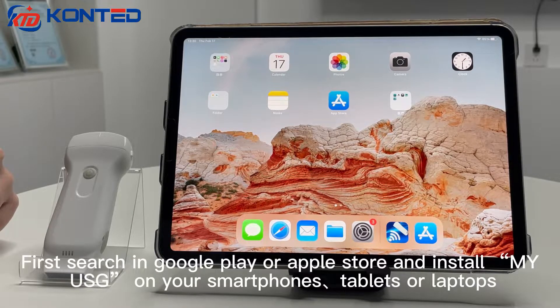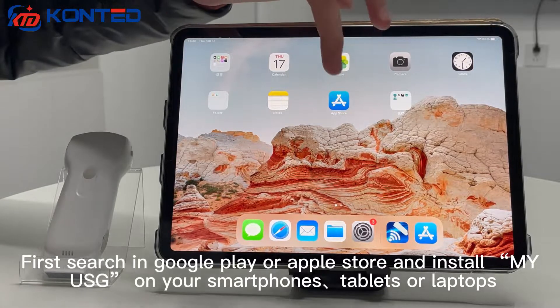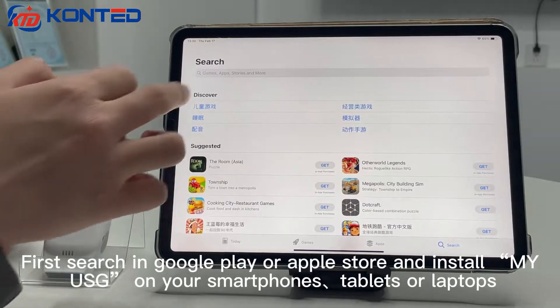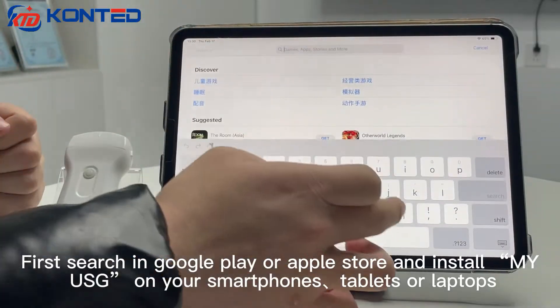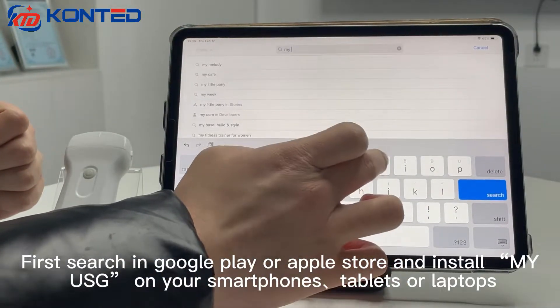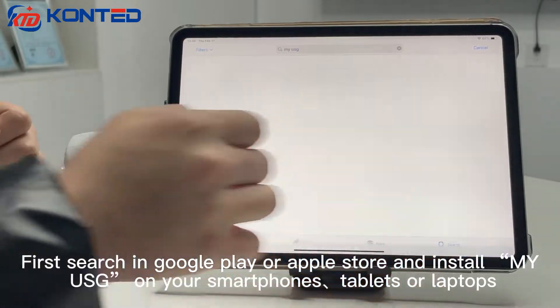First, search in Google or Apple Store and install MY USG on your smartphones, tablets, and laptops.